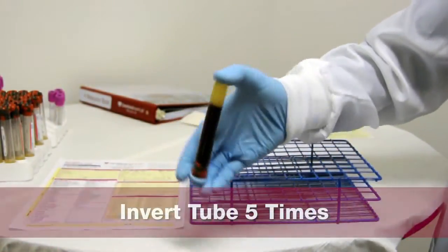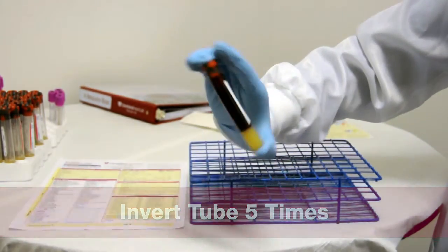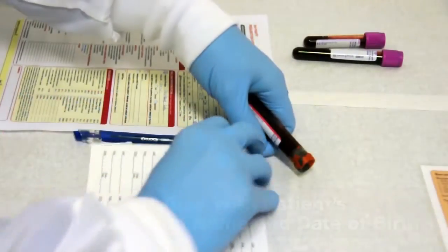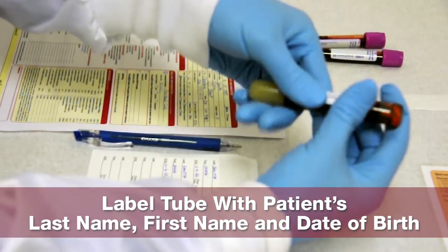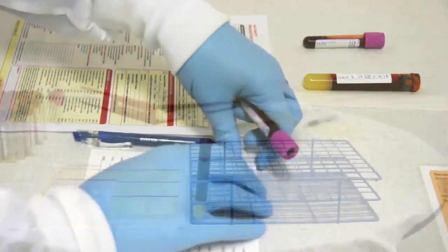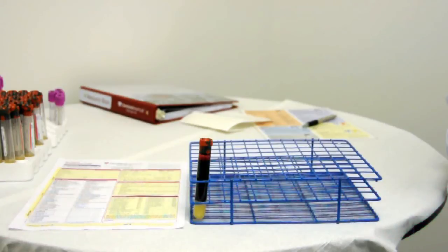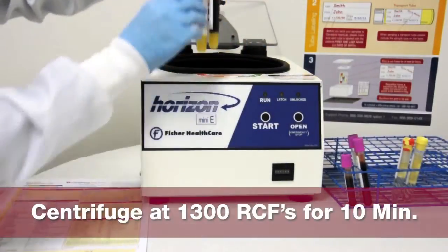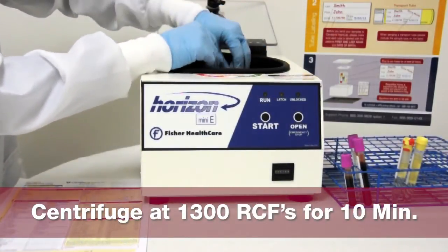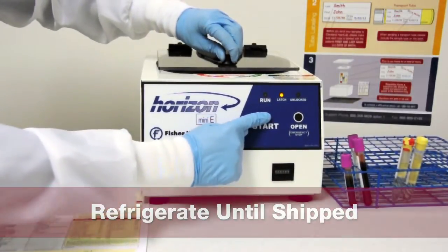Once a full tube has been drawn, gently invert 5 times immediately after draw. Then label the tube with the patient's last name, first name, and date of birth. It is essential that the patient is present when the tube is labeled. Allow the blood in the tube to clot by setting aside for 30 minutes at room temperature. After the sample has been sitting for 30 minutes, centrifuge at 1300 RCFs for 10 minutes. Please make sure to properly balance the centrifuge. Place the tube into a refrigerator until ready for shipping.